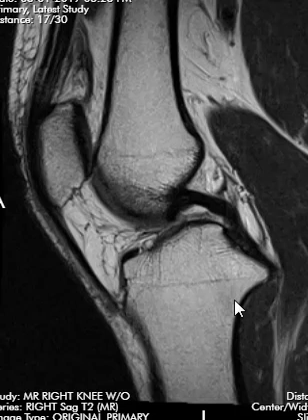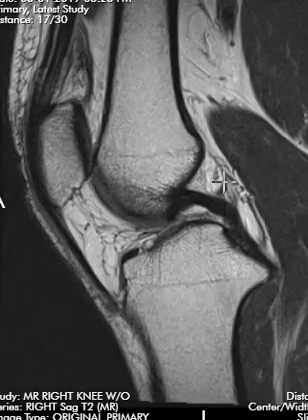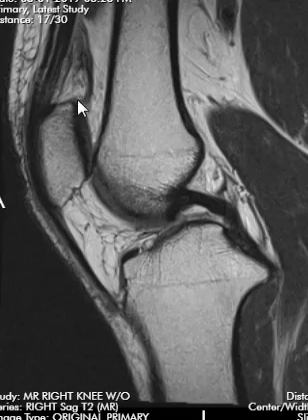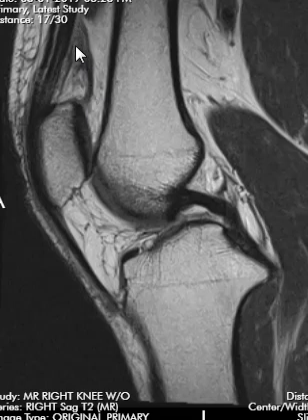Hello, this is Dr. Gay and this is a quick case of quadriceps fat pad impingement. This is a sagittal T2 view and we can see that above the patella there is darkness in the quadriceps fat pad. The quadriceps fat pad is one of the two fat pads above the patella — there's one anteriorly here, we call it the quadriceps fat pad or the anterior suprapatellar fat pad. It's dark instead of bright like fat should be, and you can see a little bit of swelling too.